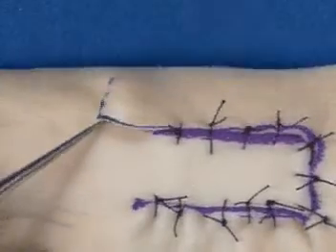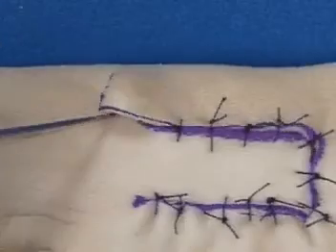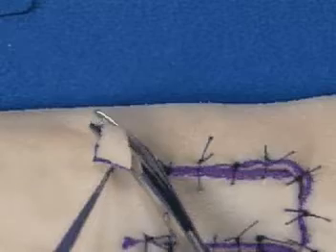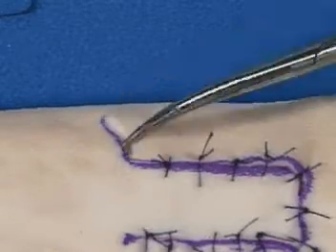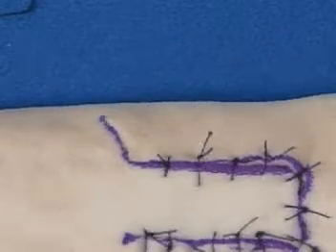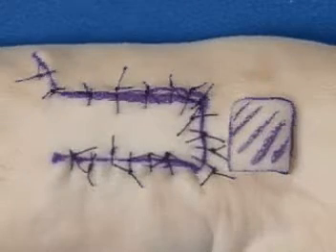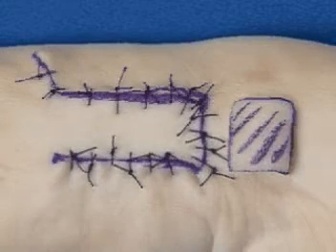Undermining is done under this dog ear deformity. The skin is transposed back until one can exactly see how much skin is needed to be trimmed. The skin is then trimmed and the flap is inset. This flap is then sutured into place and the dog ear deformity is resolved.